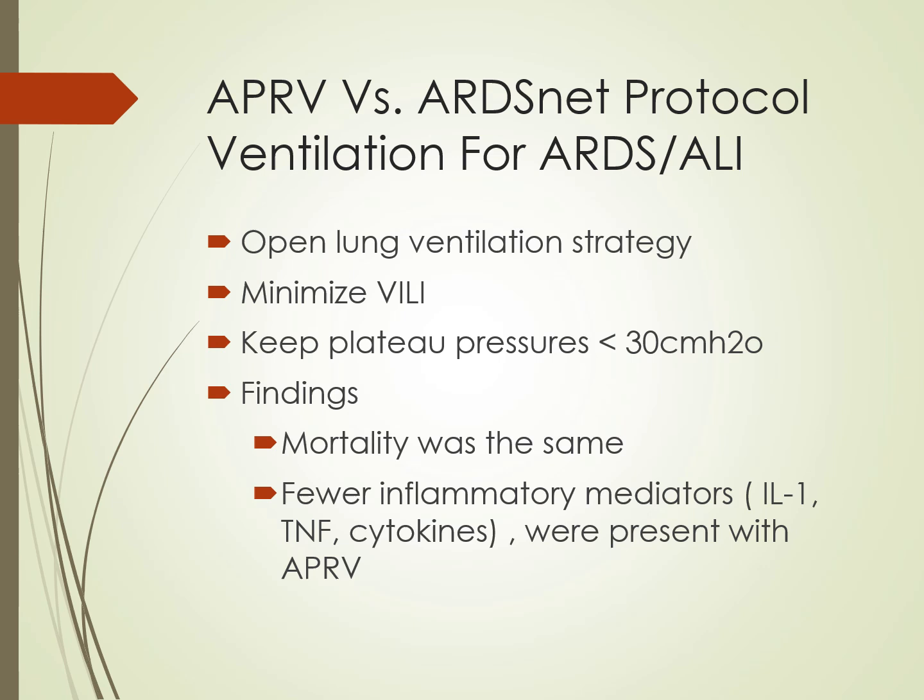The idea is to keep the plateau pressures less than 30 centimeters of water. But when they compared APRV versus ARDSnet, the finding was that the mortality was the same, but fewer inflammatory mediators were present with APRV. So it looks like APRV actually created less damage to the lung, with fewer inflammatory mediators being released.